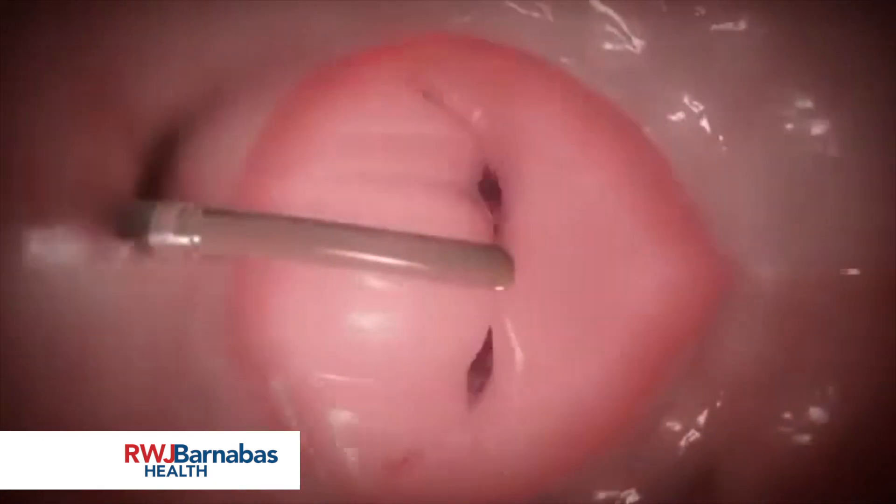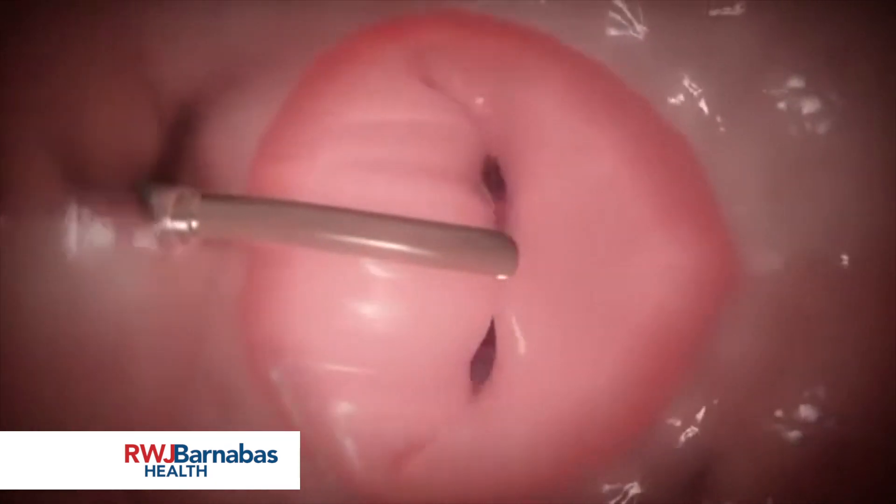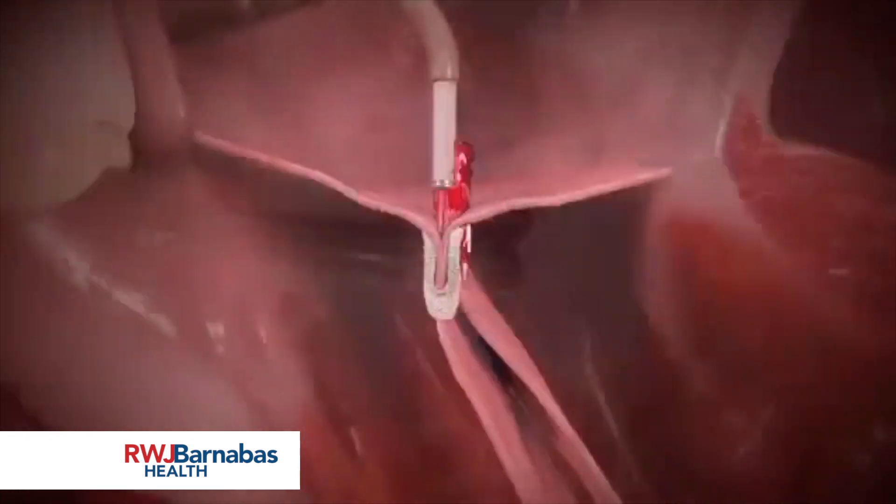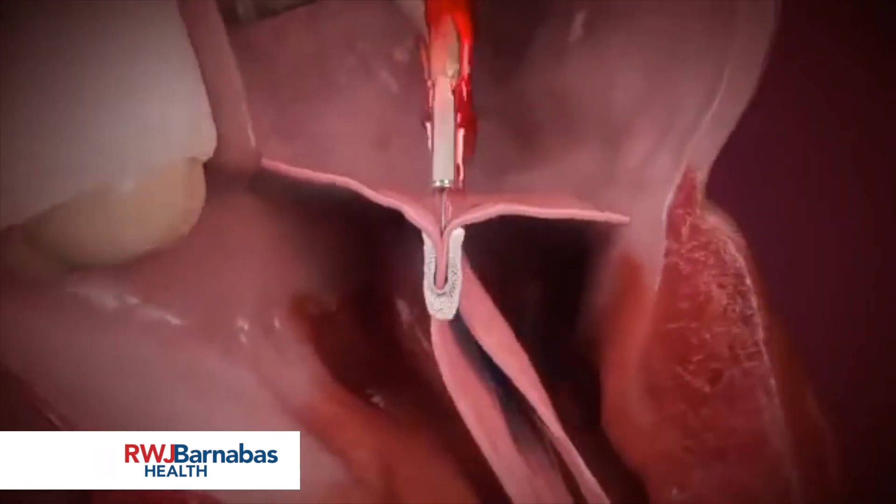Once the arms are closed, they create a double orifice within the mitral valve. Prior to clip deployment, echocardiographic imaging is used to assess procedural efficiency and leaflet capture.